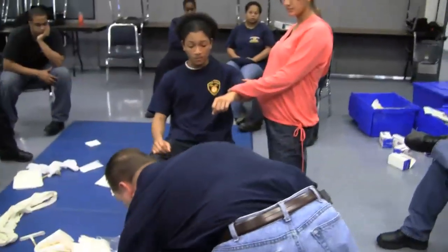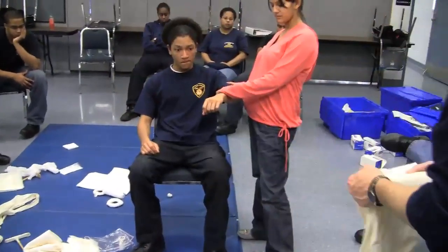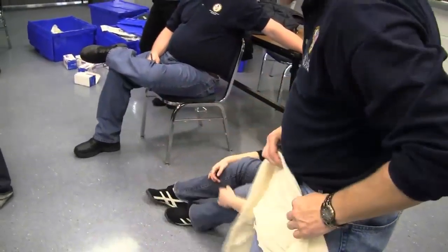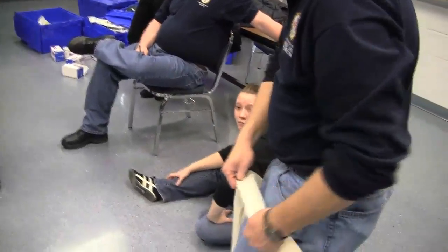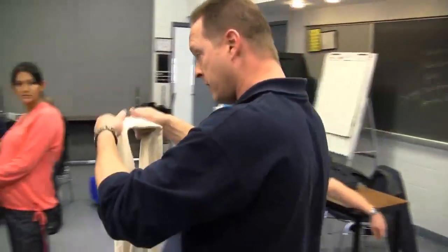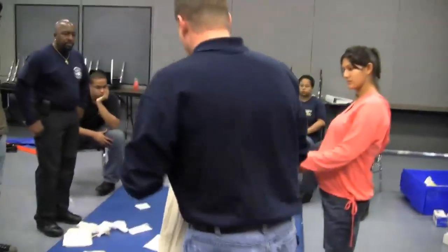Apply a tourniquet. That's another one where folding the cravat is important, because we want it flat rather than tying a rope — so remember to fold these things.